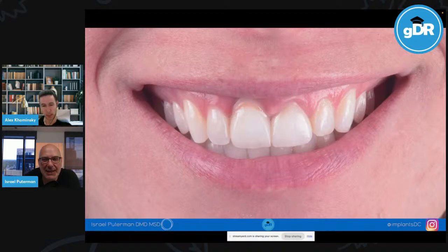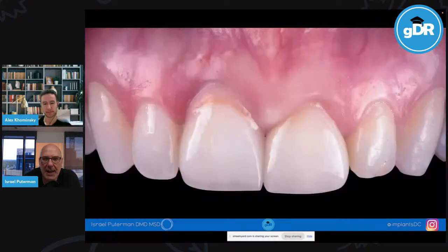And she says that she didn't think that the tooth really fit all that great. And I said, well, okay, tell me how the day went when you were at the dentist. And she says, well, it didn't fit well. And she was pushing and pushing and pushing, and it hurt a lot. And the dentist made a little adjustment and then put the crown in and said, well, yeah, the tissue's higher up, but let's just let it heal for a couple of weeks and the tissue should come down.